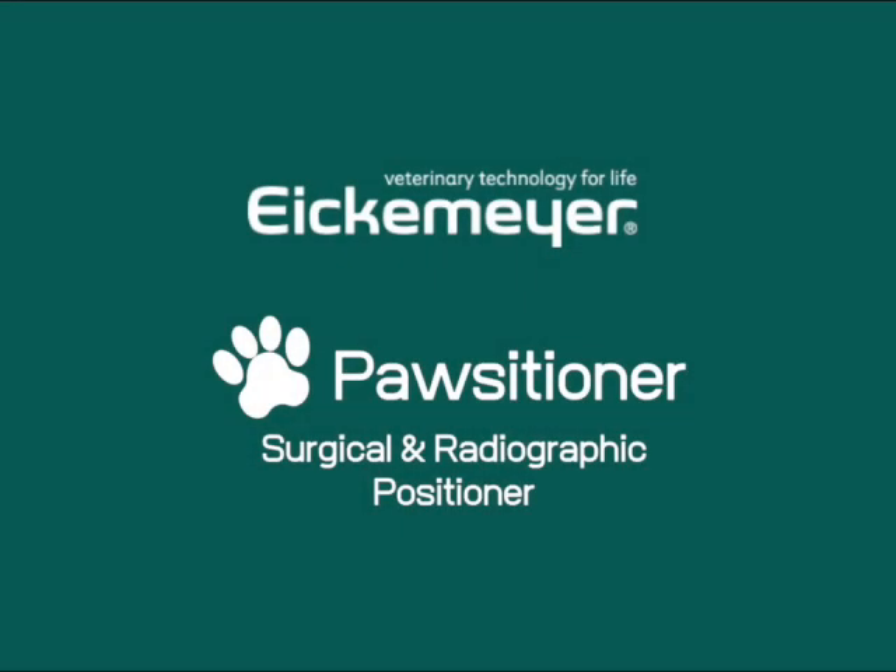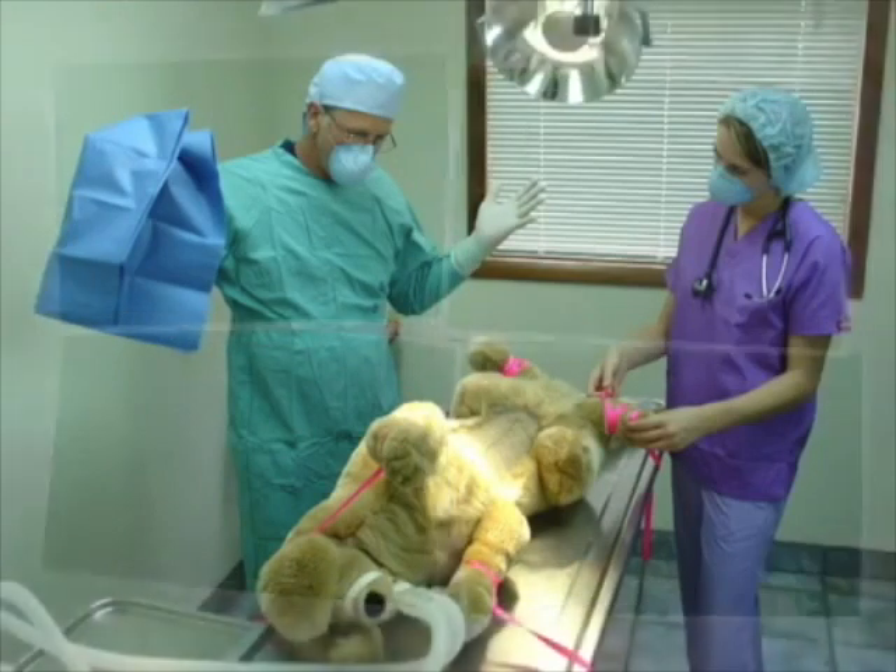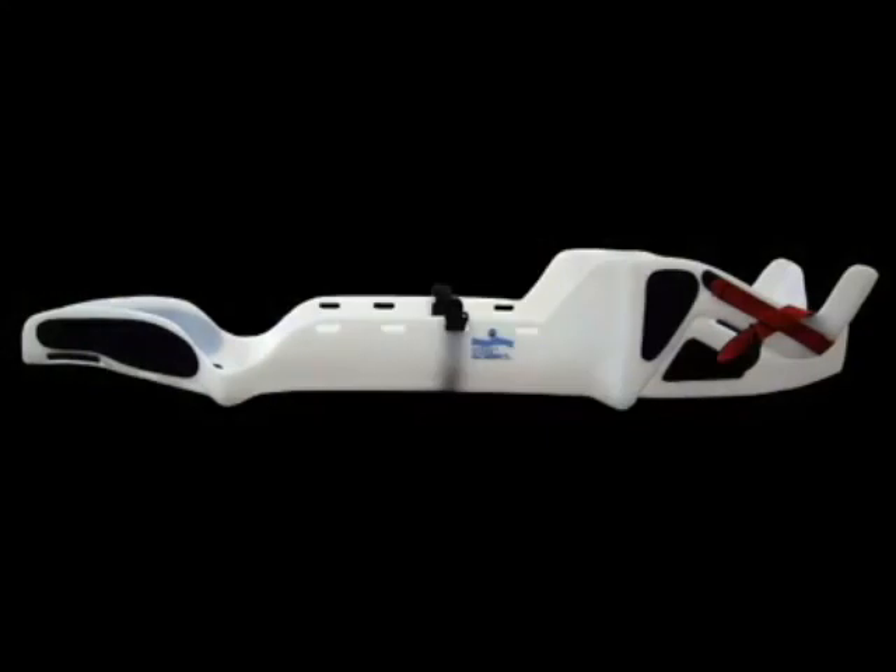Have you ever wondered if there is a better, safer, and less frustrating way to position patients in your practice? Introducing the Pawsitioner.